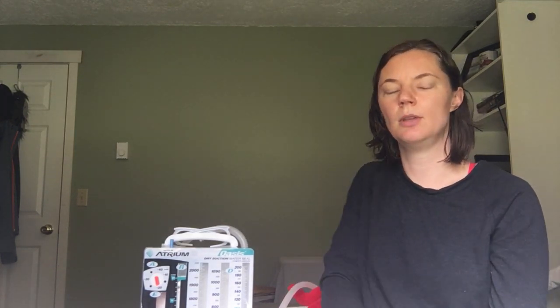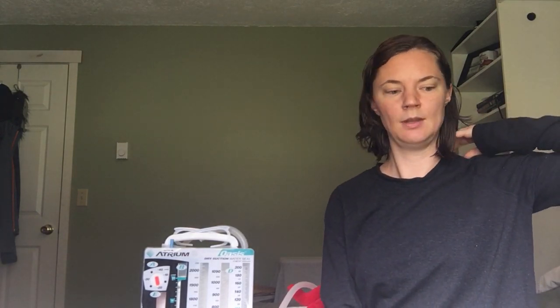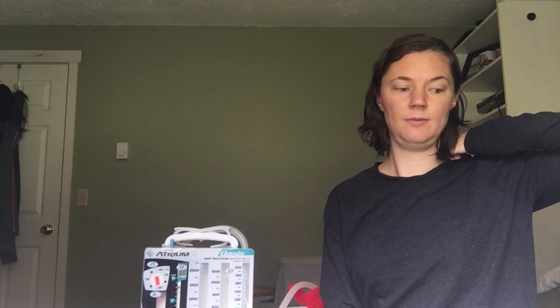Usually there is a half-tied stitch that remains in the patient, a purse string, afterward. They just tie it when they take the tube out to close the hole, and that comes out at the follow-up appointment, so let your patient know that's when it comes out, and that they might feel it there, since sometimes they leave it rather long. Teach them not to submerge themselves in water. Most rooms in the hospital don't have a bathtub, but I know we have a room that does, so don't let them do that. They're not even supposed to do it when they go home until after their follow-up appointment with their doctor, when they get confirmation that it's all sealed closed and not going to get water in there.